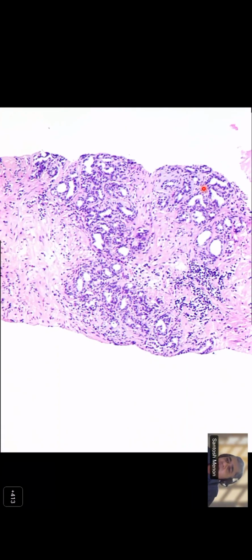So Niharika and Poonam. Yes, sir. Sir, in this prostate biopsy core, we can appreciate irregular shaped separate non-fused glands. Non-fused glands, very good. So they are separate looking glands, very good. Yes, sir. And sir, we can also appreciate there is absence of the basal layer. Wow, you can see the basal layers. You can see the absence of basal layers on morphology.